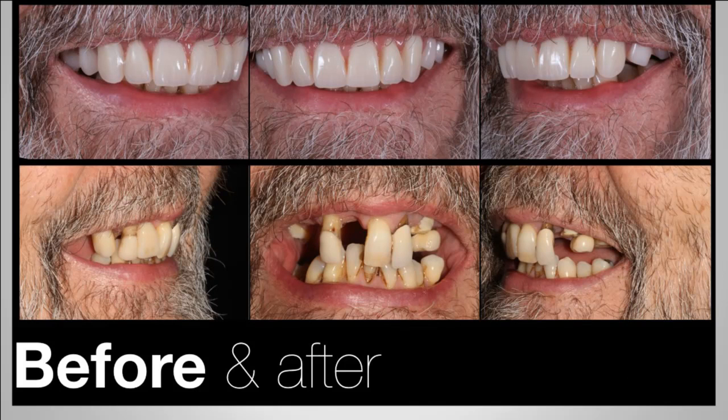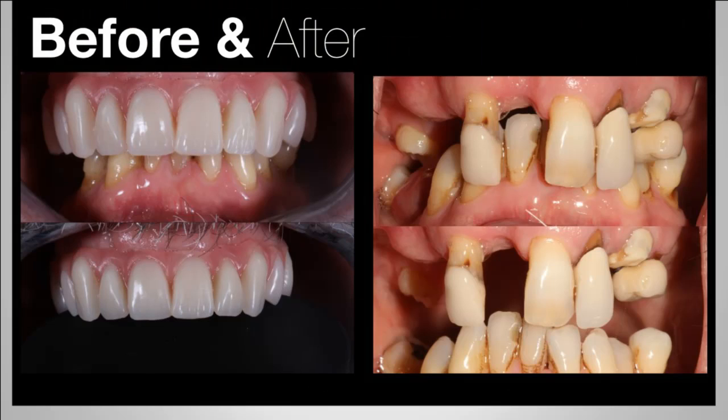And this is the case before and after. You can see we've got a nice aesthetic result that's aesthetically pleasing to the patient whilst being able to load the implants immediately, so he hasn't had to go through a denture stage.